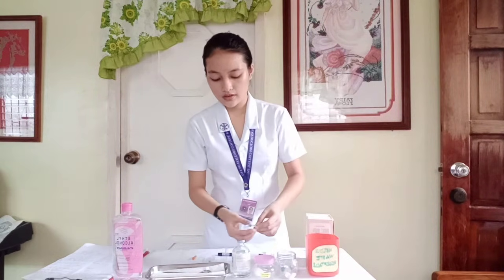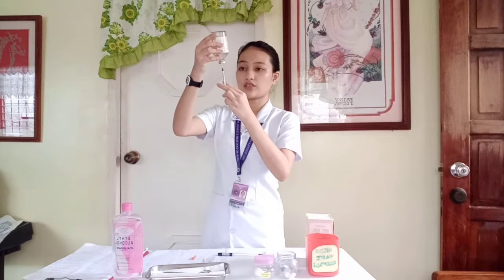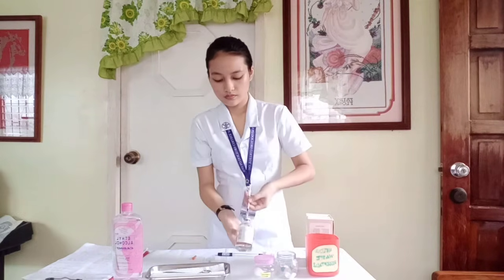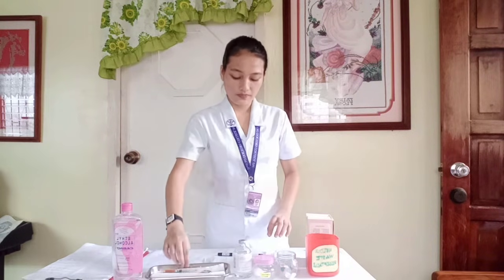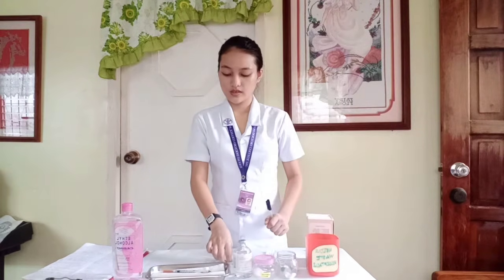Okay, and then inject the air into the vial, invert the vial, and draw the medication up to the exact amount needed. Now there's no air bubbles, so we can just cap it and place it on a hypodermic tray, and then write the drug name and dosage into the medication ticket. Place it also in the hypodermic tray. Check the doctor's order and the patient's chart.